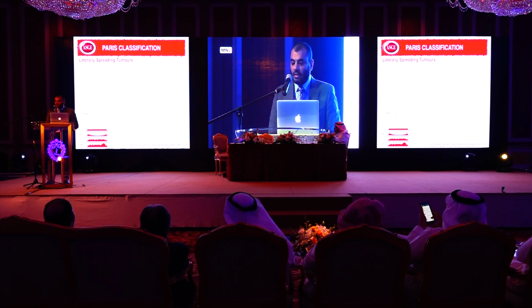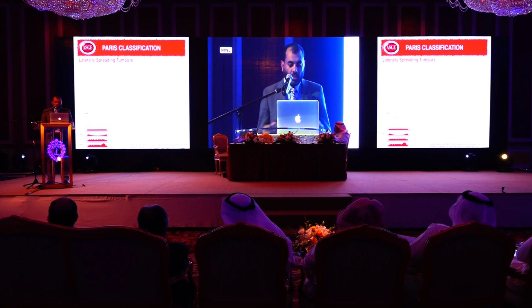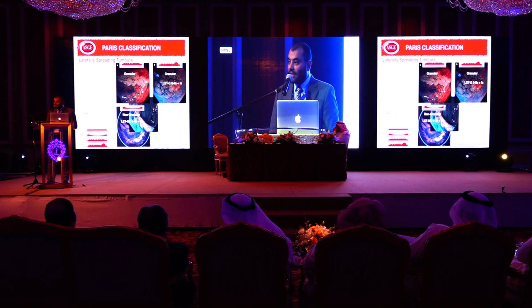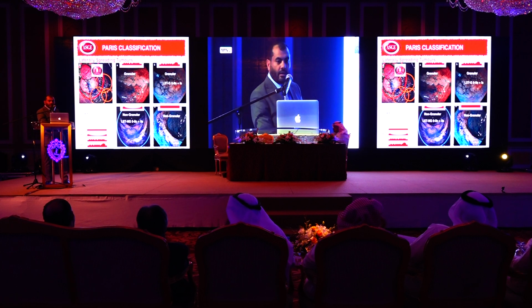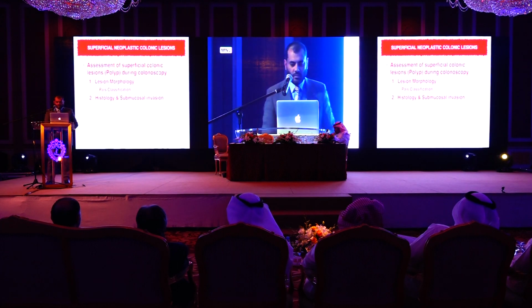Lateral spreading tumor is a superficial lesion more than 10 millimeters in diameter that extends laterally rather than vertically along the colonic wall. It has 2 types: granular, which is homogeneous or nodular mixed type, and non-granular, which is flat elevated or pseudo-depressed. This large nodule in this granular LST type is alarming for the same finding, invasive carcinoma. And this demarcated depressed area is also alarming for the same finding.